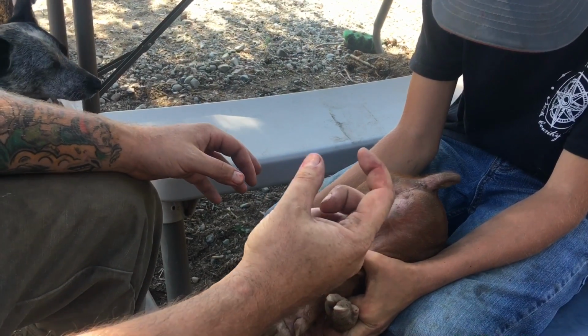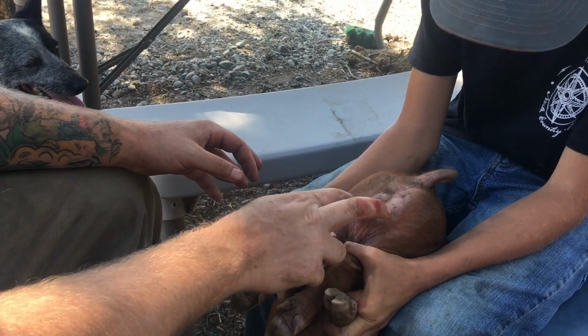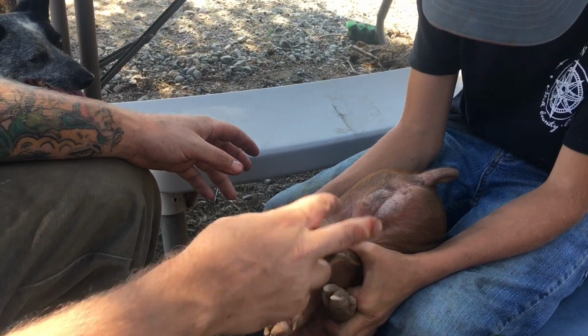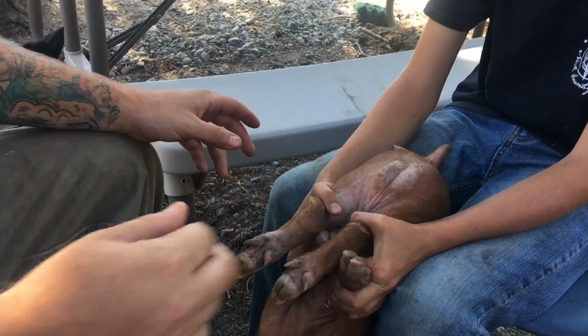You don't want it to be real big. You want to be able to pop it through. These guys got pretty good sized testicles. They're about 2 weeks old, so they're a little bigger than usual.